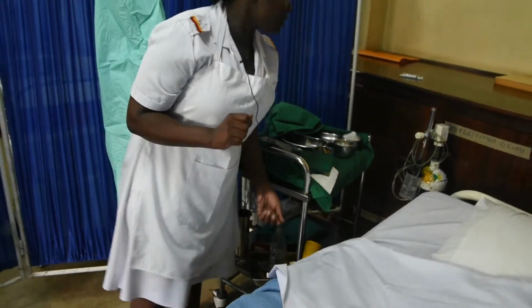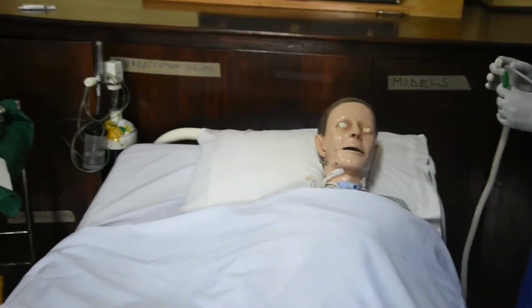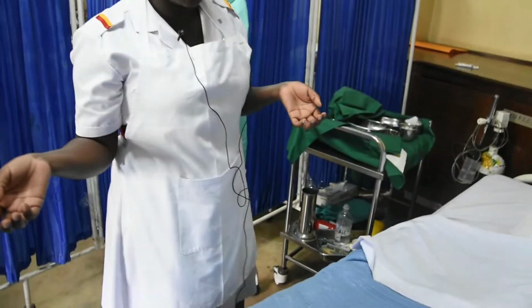At the bedside, we shall need an oxygen cylinder, which is well connected. We shall need a suction machine, which is well connected. We shall need a screen for creating privacy. We shall need aprons for protection. And then lastly, hand washing equipment.